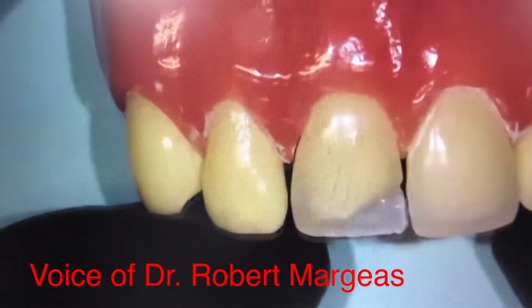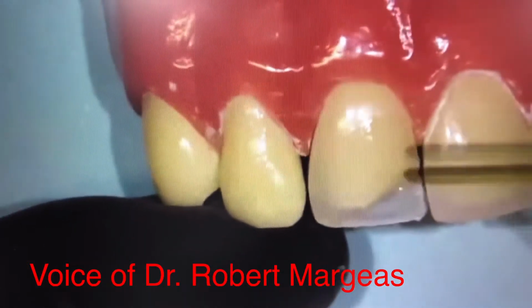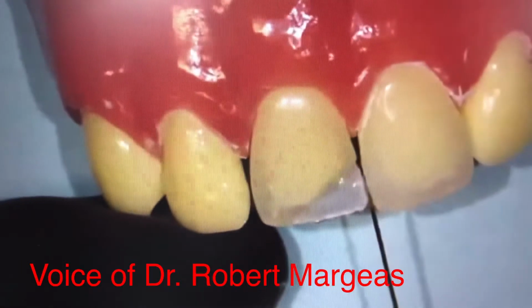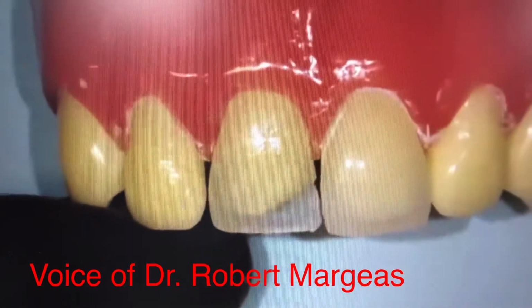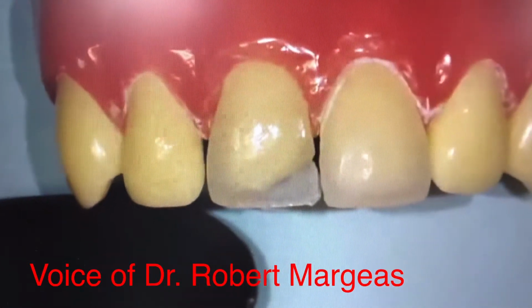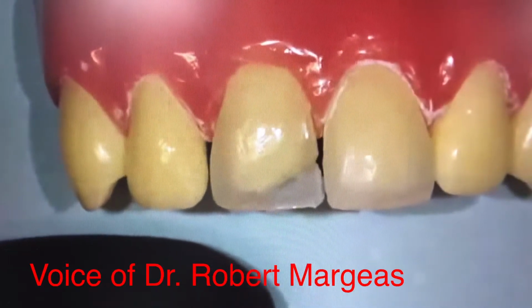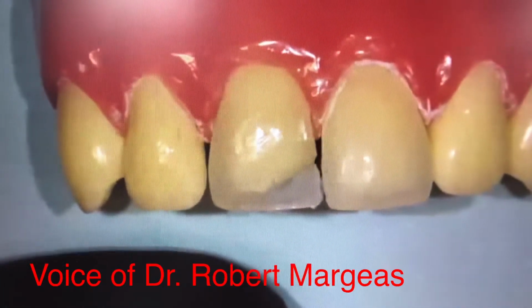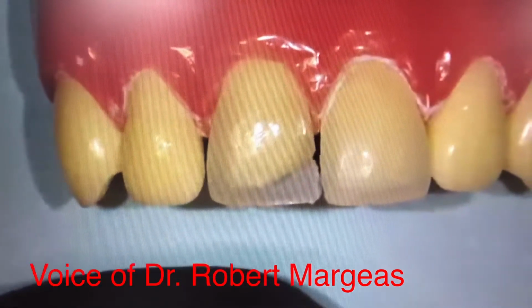This is only to hold the material for the next layer. So don't worry if you don't have a contact here. It doesn't matter, because when we do our pull-through technique, you're going to have a perfect contact. We're not going to use wedges. We're not going to use matrices and hold it. You're going to see exactly how we do that. So go ahead and get that part done.